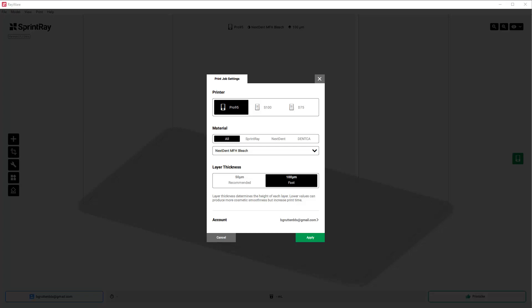In this video I'm going to show you how I would set up a print for some of these healers. In this case, I'm using the Sprint Raid Pro 95, and I'm going to be using the Nextdent MFH resin, which is a crown and bridge material.